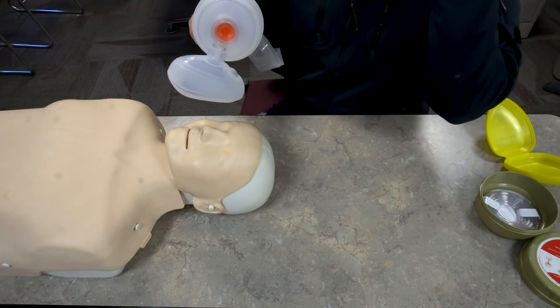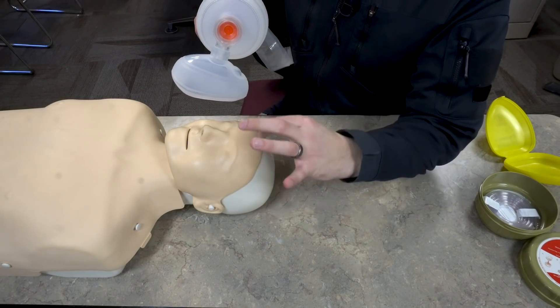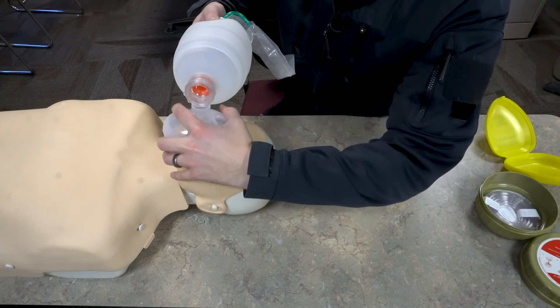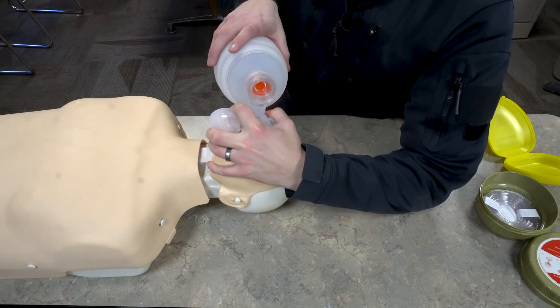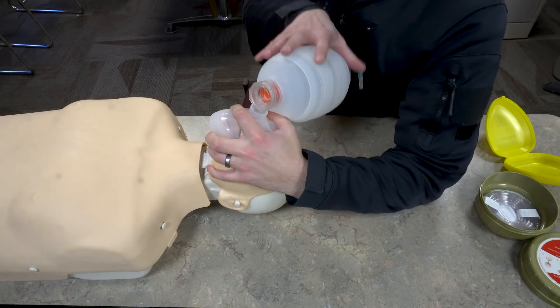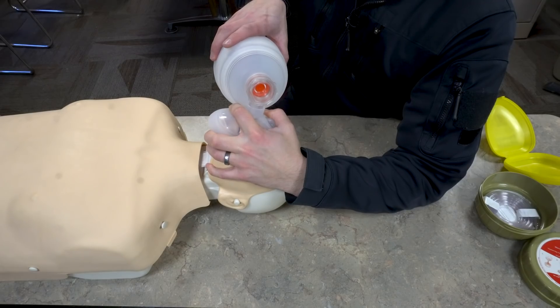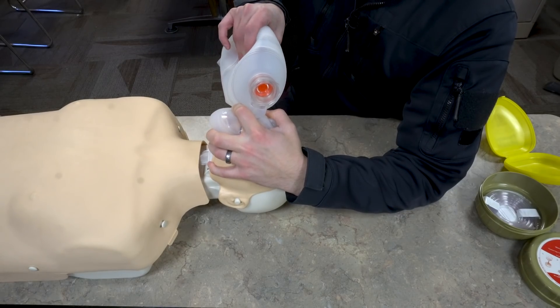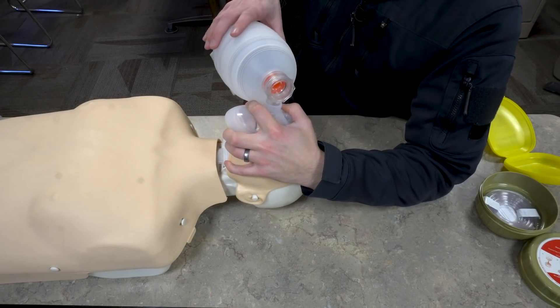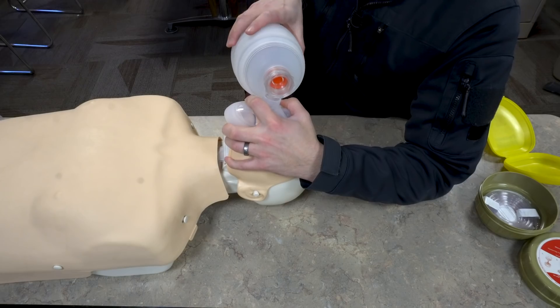To make a seal around a patient's face with this mask you're still going to be using the EC technique. I've got the C and the E — I'm going to put this on the bridge of their nose and rotate down, grip and pull back under the patient's jaw. Now you can see this is a lot harder to get that seal because I've got nobody on the other side. So I usually take the bag and press it down slightly on that side to get a seal all the way around the patient's mouth, and then squeeze the bag only until we see chest rise. We don't want to hyperinflate their lungs — this is a pretty big reservoir so we don't need to fully deflate it when we give them a breath, only until we see that chest rise.